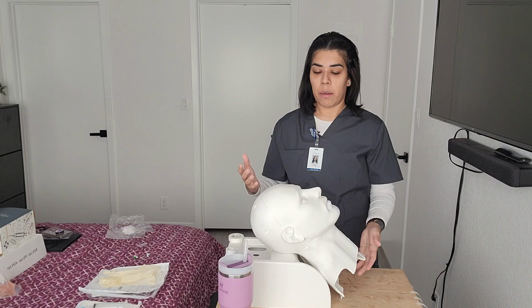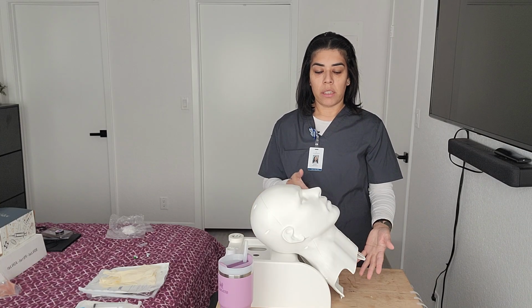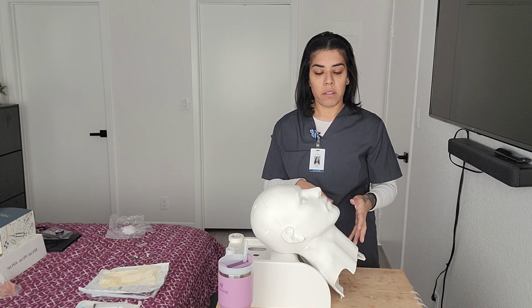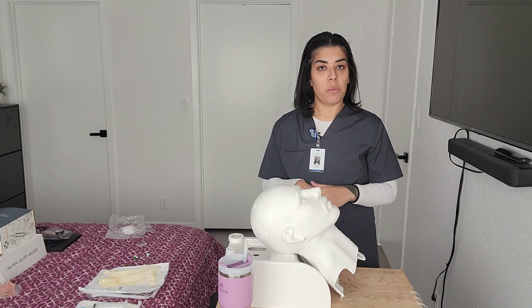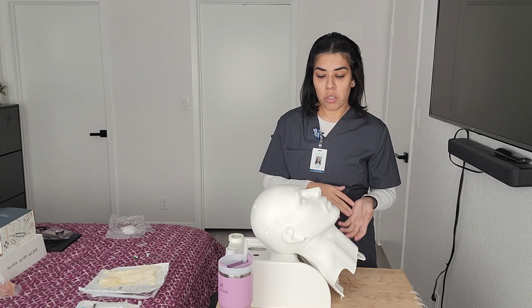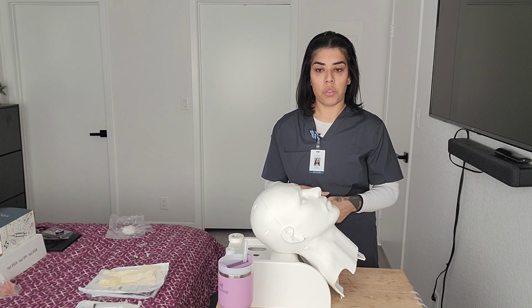So we're gonna go ahead and put the patient in a high Fowler position. We're gonna check the vital signs. All the vital signs are within normal range. The only thing we are gonna do different is we're gonna keep our pulse oximeter on the patient so that we have those readings as we are doing the NG tube insertion.